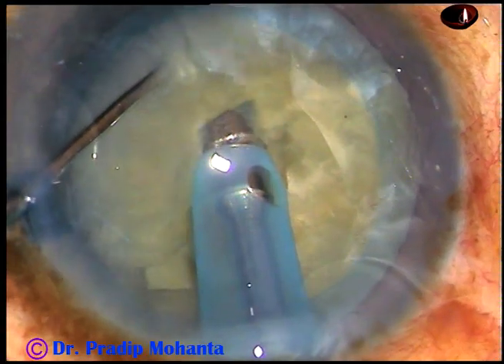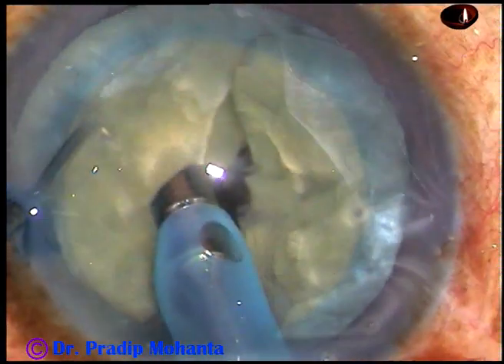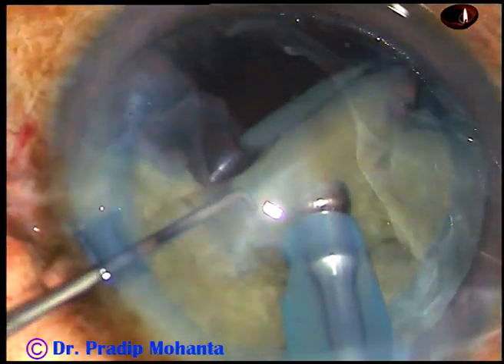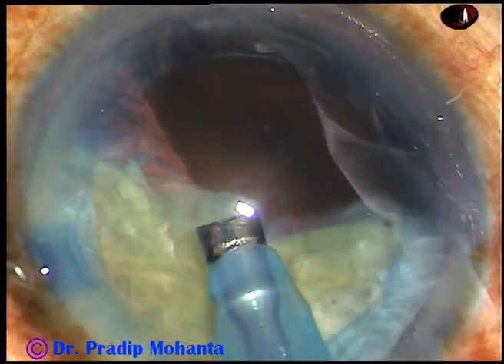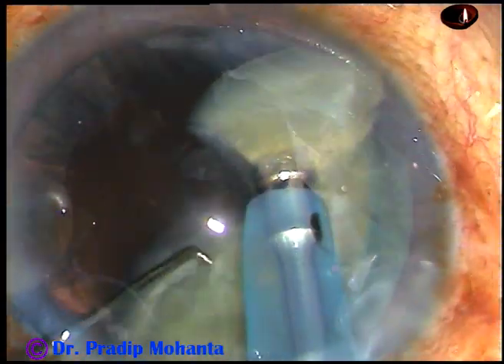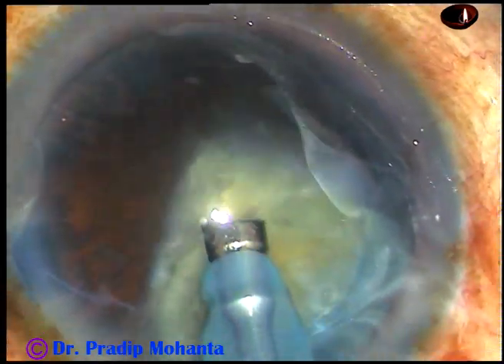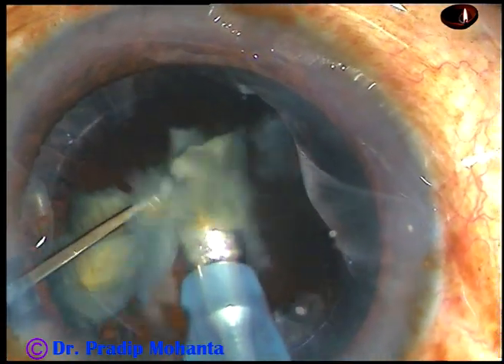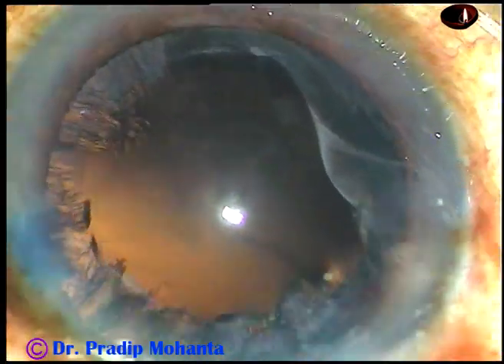Rotate the nucleus, hold it at another place and make another chop. Rotate the lens matter and chop the other hemi-nucleus. The nucleus has been divided into four pieces. Each piece is then emulsified using ultrasonic energy, which is 60% in this case, and then the pieces are removed. The vacuum used in this case is 450 mmHg and flow rate is 45 ml per minute. Nucleus and epinucleus have been managed.